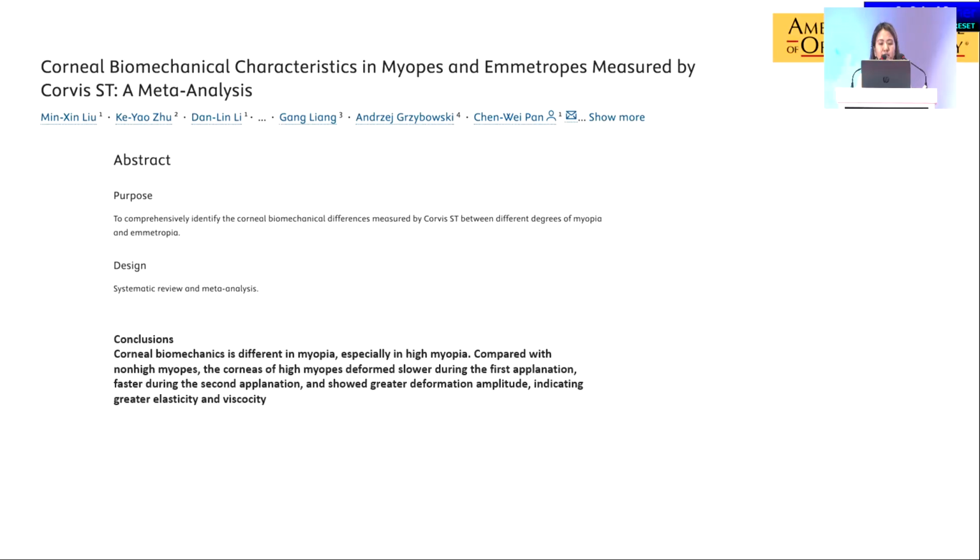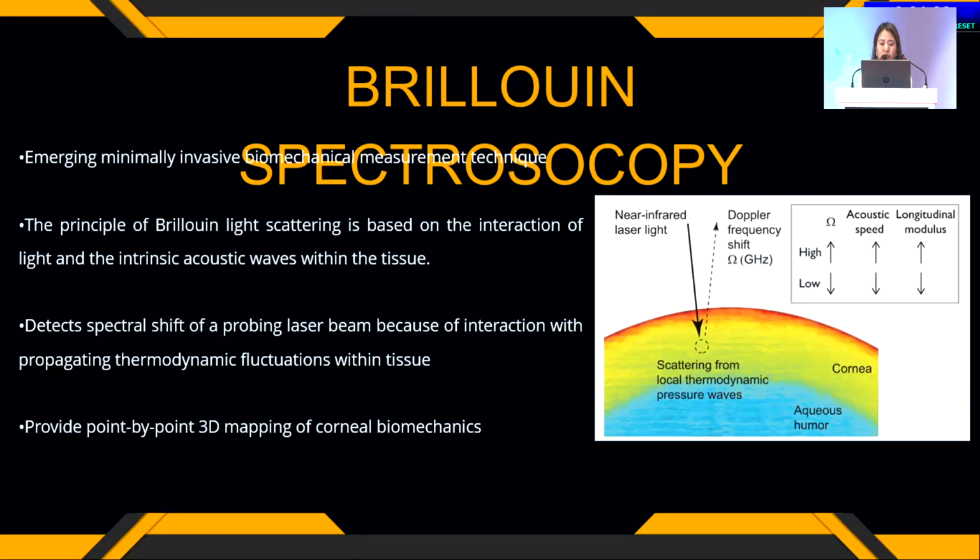So that has an application in our patients with very high refractive error, where we usually do not advise corneal based procedures. We advise them maybe lens based procedures also. That also shows that as the refractive error increases, as spherical equivalent increases, our corneal biomechanics also goes down, irrespective of the keratoconus or anything. So again, I'm sorry about the slide being mixed up.